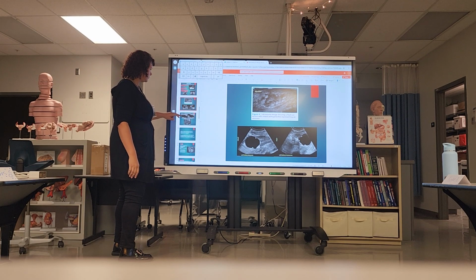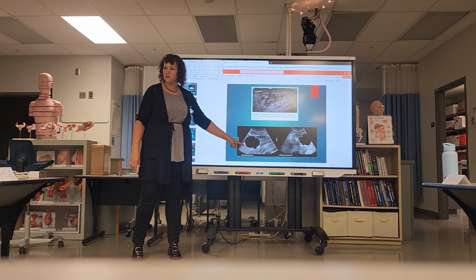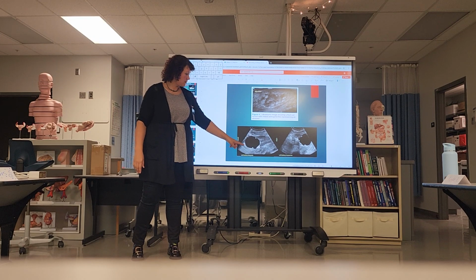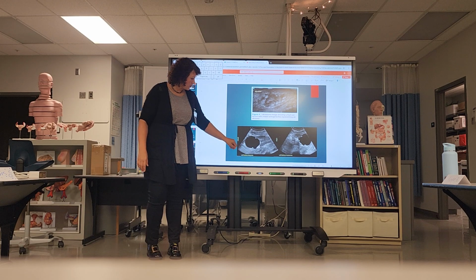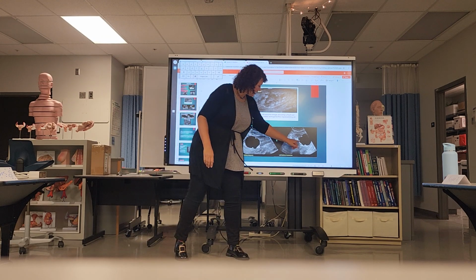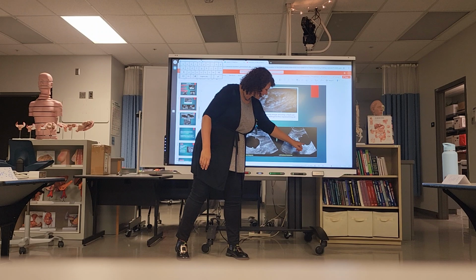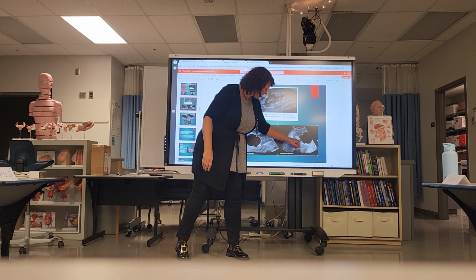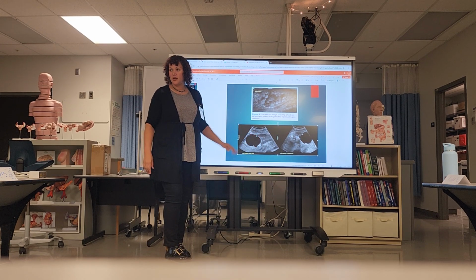And the echogenicity for the second object is anechoic, yes. It is a cyst with no echoes inside. Well, we've got a couple of echoes right here. I'm not exactly sure what that is, but it's on the periphery. I wouldn't worry too much about it. It might be part of the wall. For the most part, this is anechoic.